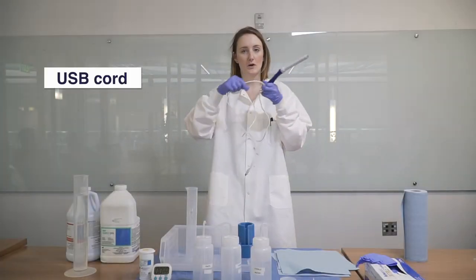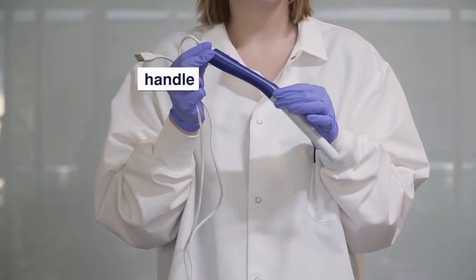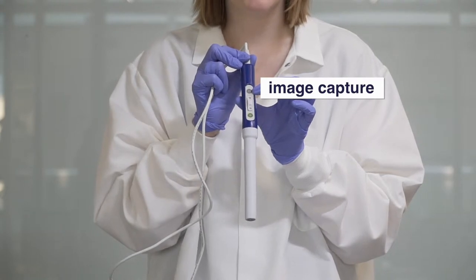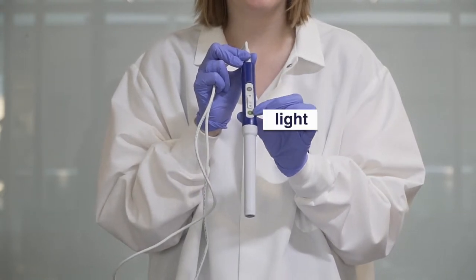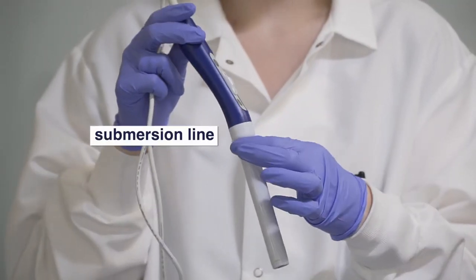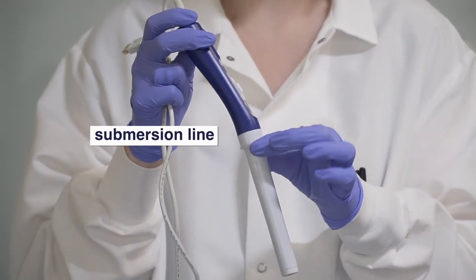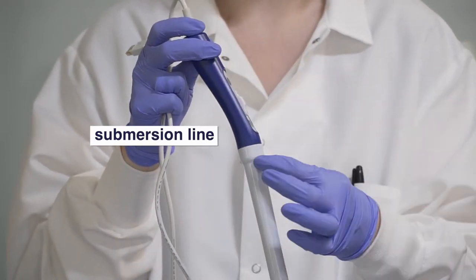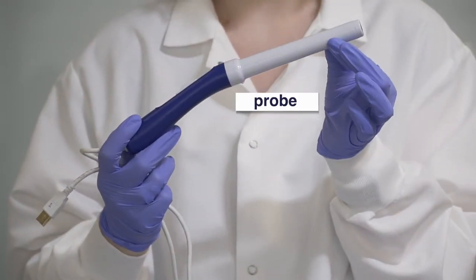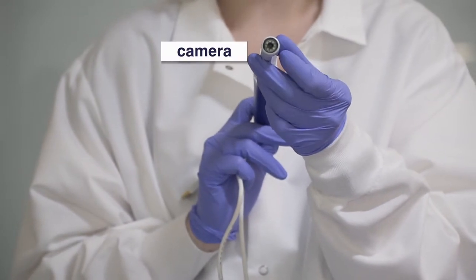This is the USB cord. The blue part of the device is the handle. This is the focus slider, the image capture button, and the light button. This is the submersion line. Be sure not to get the pocket colposcope wet or submerge it in a liquid above the submersion line. The white part of the device is the probe. At the tip, you have the camera with the light in the center.